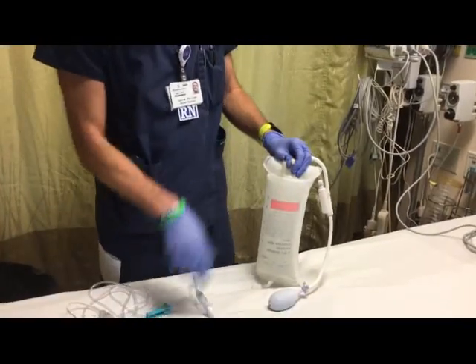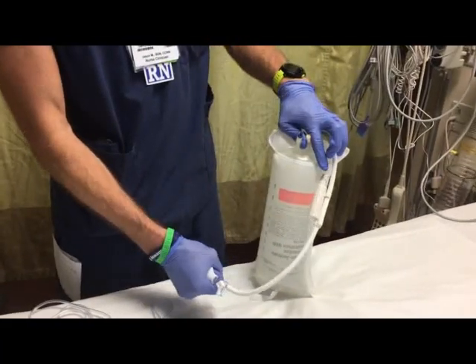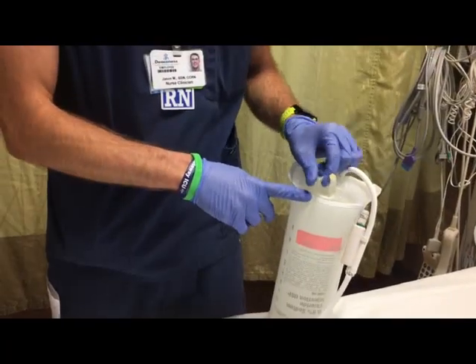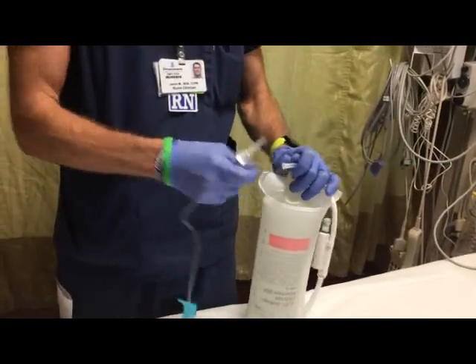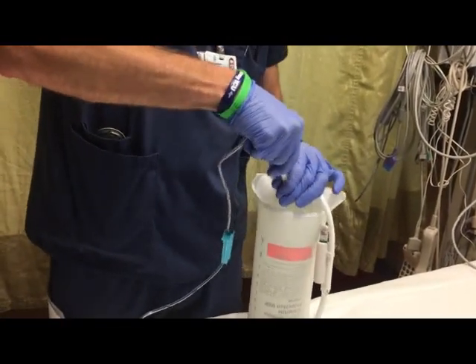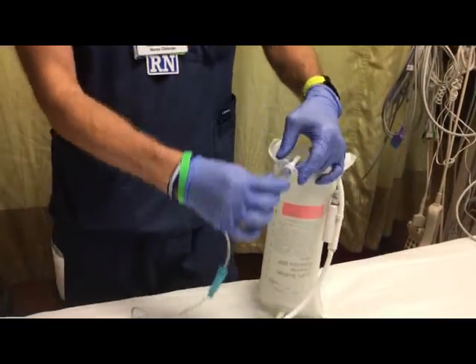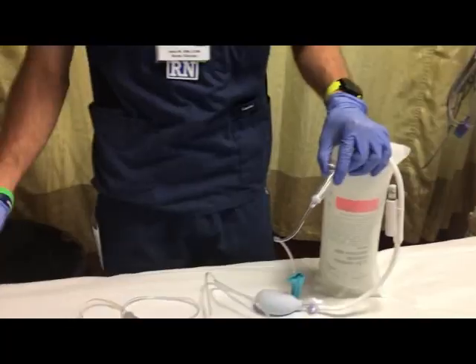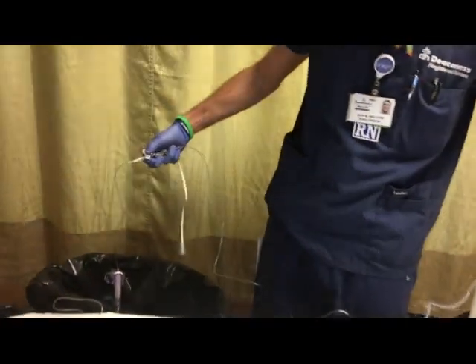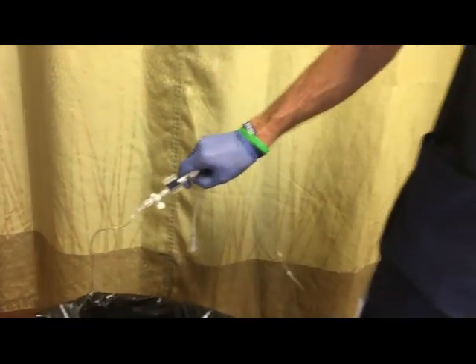I've opened my tubing and my saline bag, and inserted it in the pressure bag. I apply enough pressure to see green, and now I'm going to spike and prime my line. Insert the spike and do not remove it. While my bag is upside down, I'm going to turn my chamber upright. I'm going to activate my fast flush and prime to the air-fluid interface.